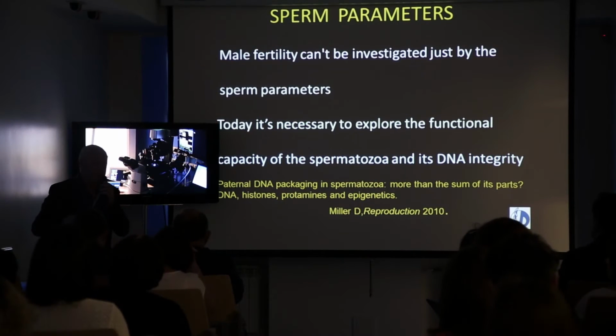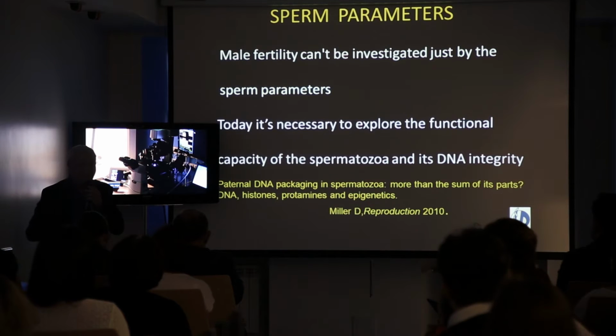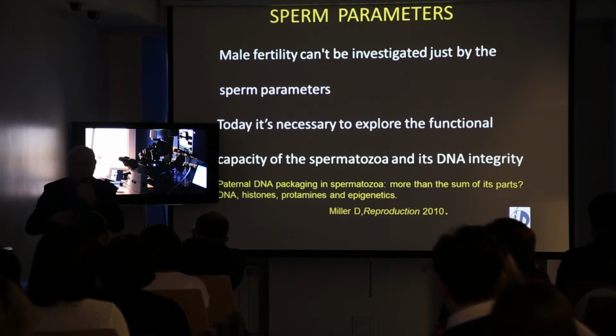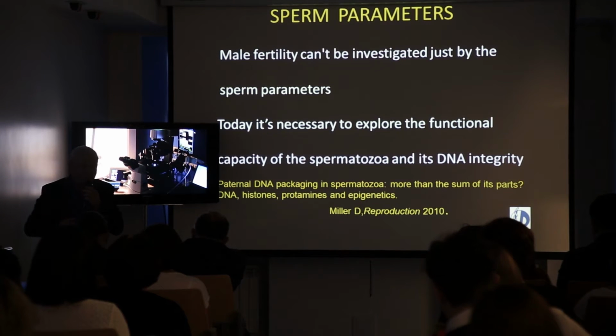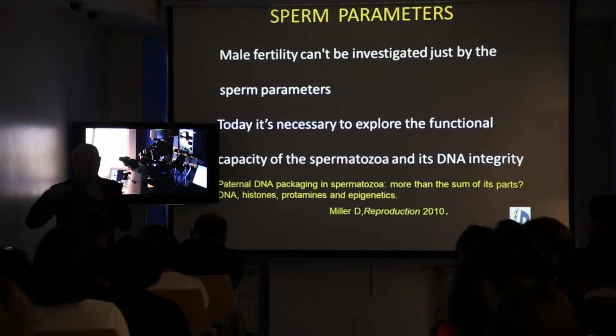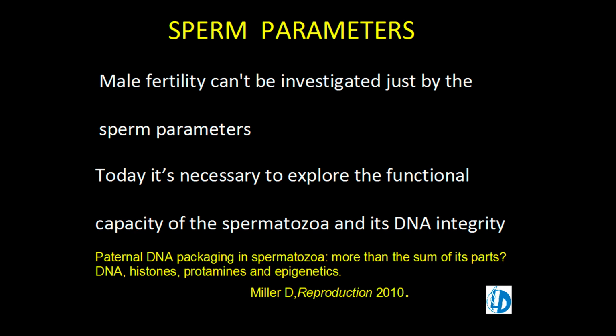I'm talking about the sperm, and just to understand what you are doing every day in the lab. Actually, all the people are looking at the oocytes, looking for different markers, different items to choose the oocytes. I think it's important, but also not very, very important, because for a biologist, for embryologists working in the lab, we can do nothing with the oocytes.